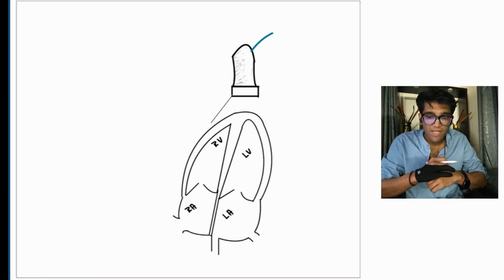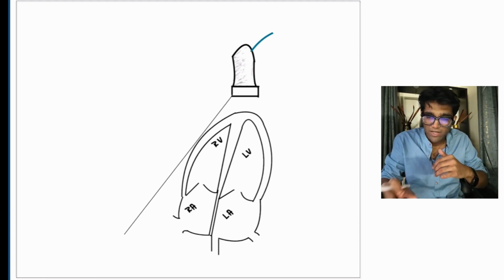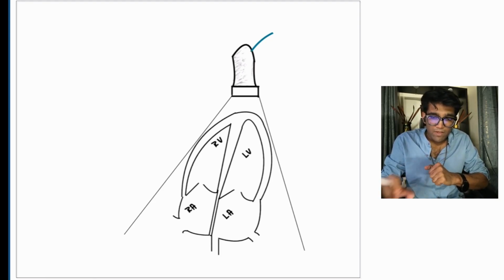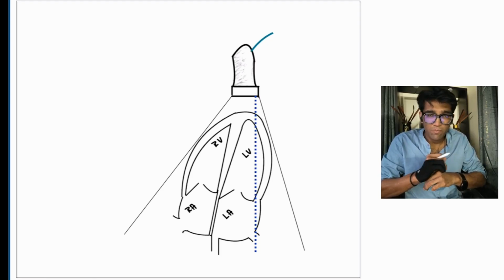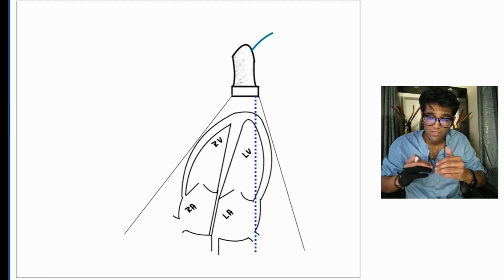Okay, and there's another mode which is actually an older mode but needs to be understood a little bit more. So that we call the M mode. Okay, so what do we do in the M mode? So M mode is basically just like the B mode. Okay, so we're making differences in the amount of amplitude waves that are reflected at different times and therefore different distances into the tissue, representing it along a line.